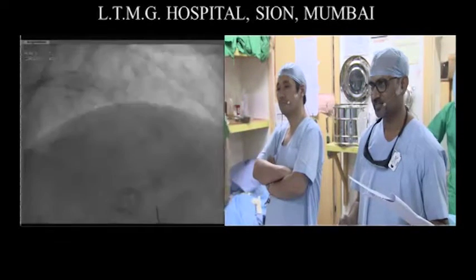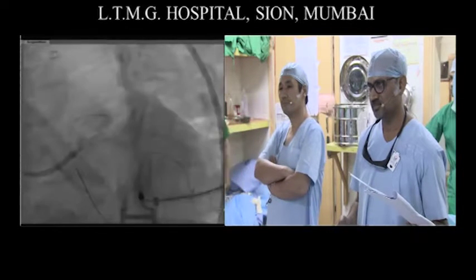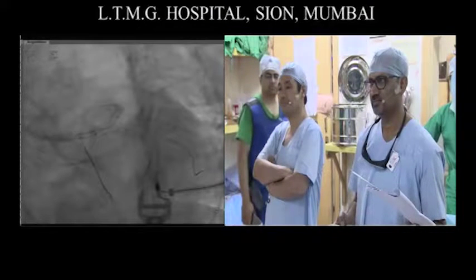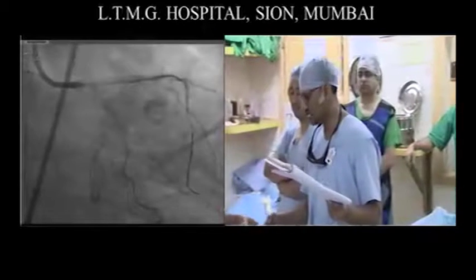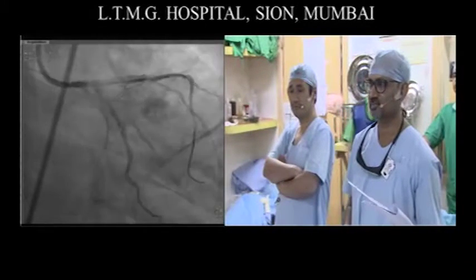Sometimes running the OCT after the LAD stent is in and just looking across to see what that orifice looks like can gauge whether you need a stent or not. So sometimes that helps you to make another run before you put the stent in the circumflex.